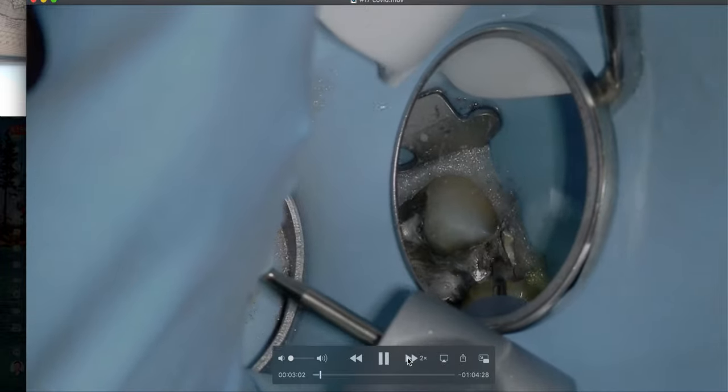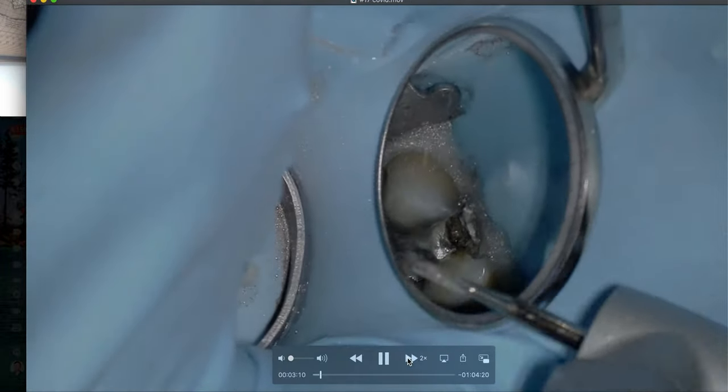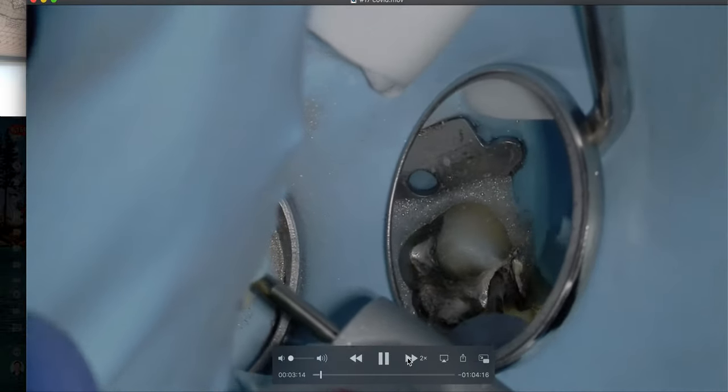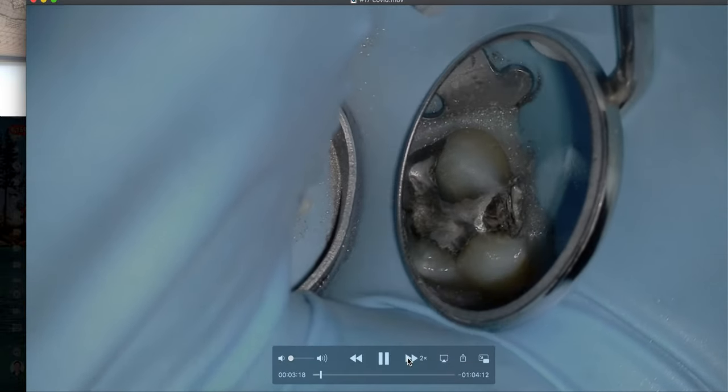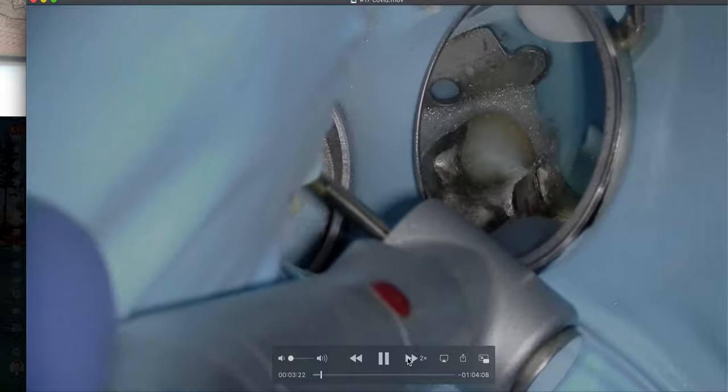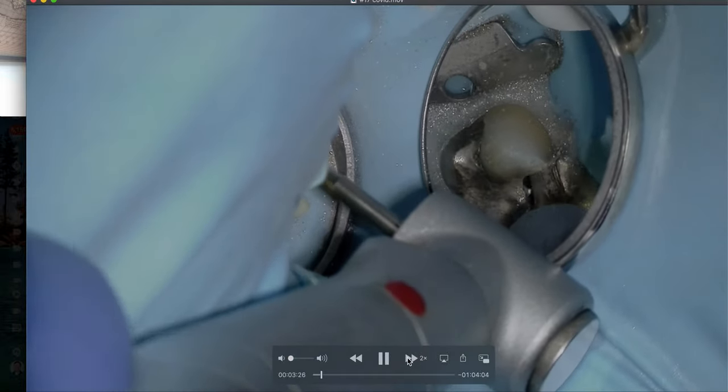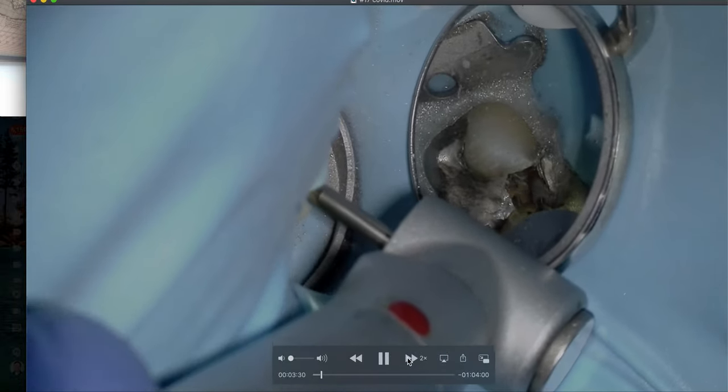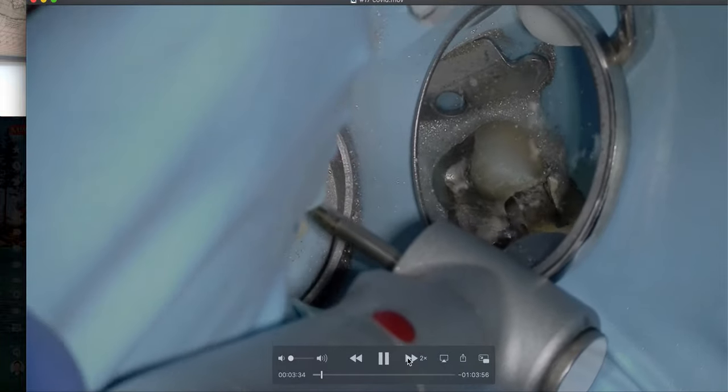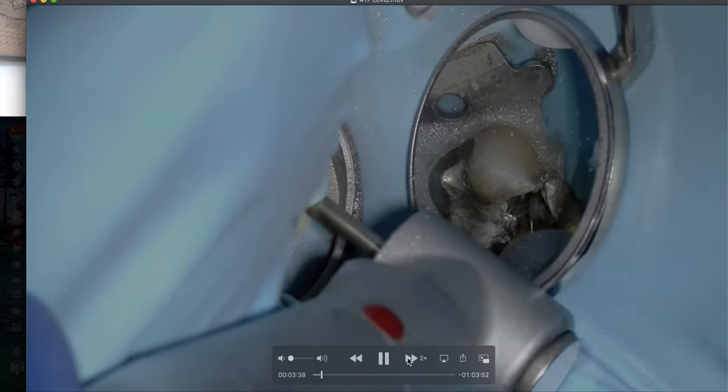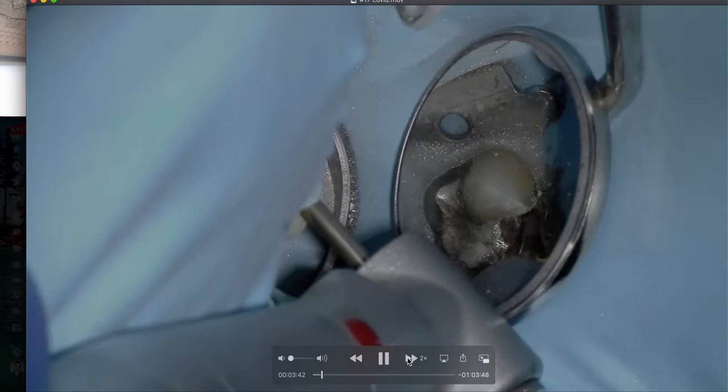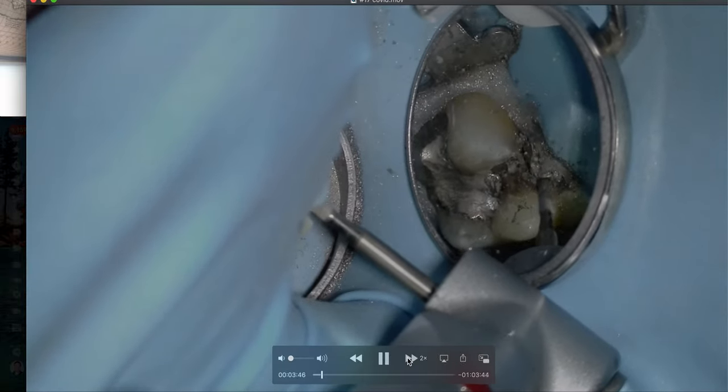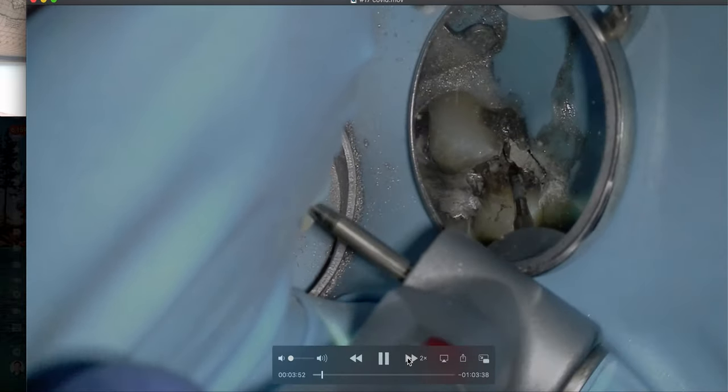So let's go ahead and we'll just do it in high speed here. So this thing, I mean, it doesn't quite cut like butter, but it is super effective. I was actually really impressed. I've been impressed all times I've been using it. I haven't tried on cutting through a porcelain crown. I'll have to use a diamond with that. But I'm going to show you in this case, we're going to use a 557 just to remove that restoration and some enamel. It works really well.